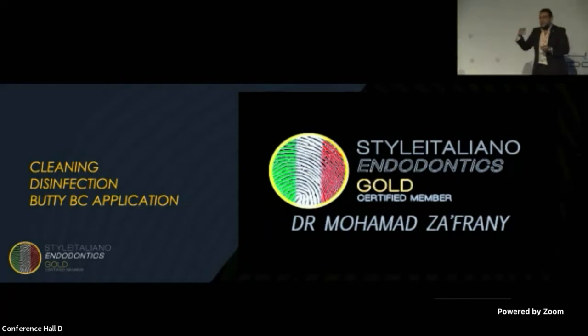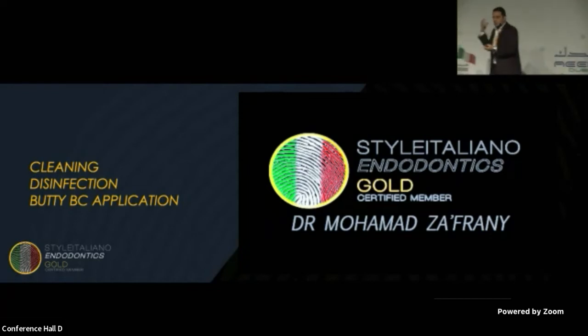However, if canal anatomy changed, prognosis will be low or it will not be good. We manage apical plugs, we manage perforations, and we know that locating the anatomy is very important, and also adapting our knowledge to the anatomy is very important, not adapting the anatomy to your knowledge.